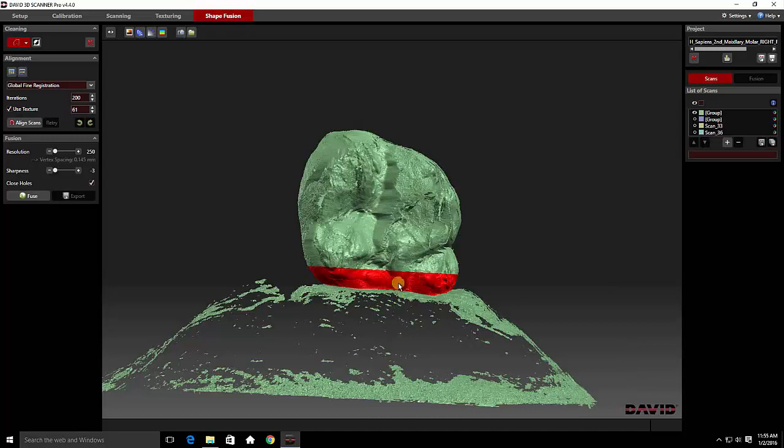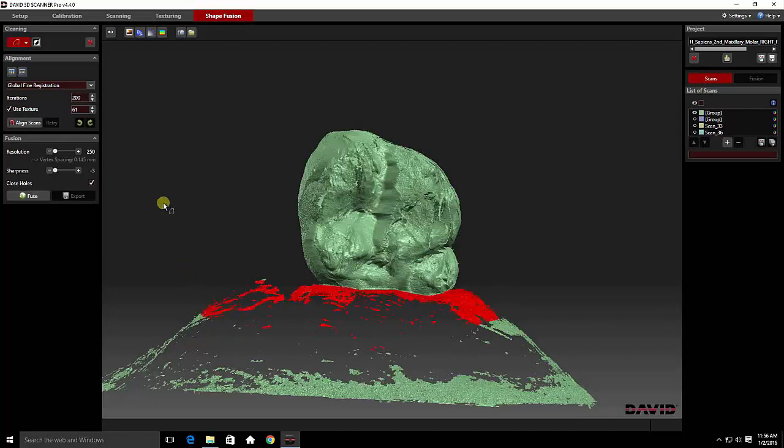That was an accidental mouse click, and you can see it did something very bad to my model. Keep an eye out for red. If this happens, just simply click on the cleaning button and it will eliminate that. And delete.